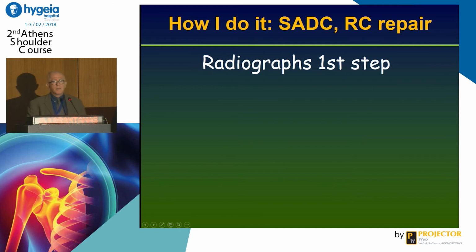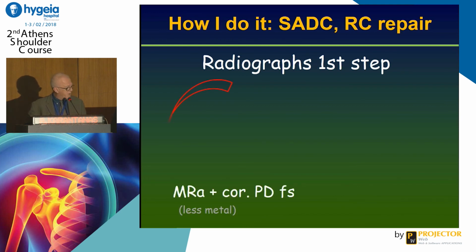So how I do it, according to my personal experience and also the evidence suggested by the literature, I need radiographs which have been taken because of the current symptomatology, but I would appreciate having access to radiographs which were taken in the immediate postoperative period.